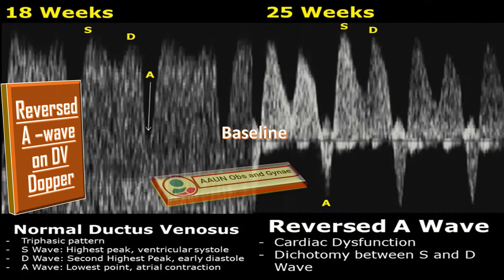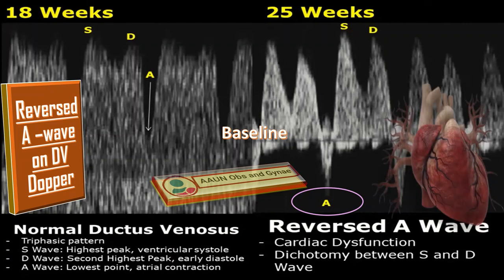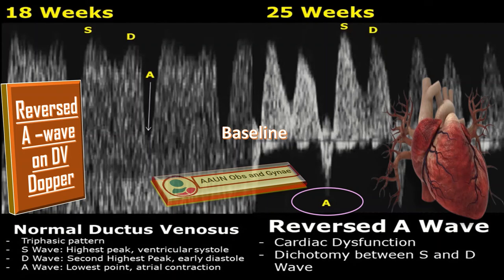Next comes the reversed A wave. The reversed A wave means the A wave is below the normal baseline on the ductus venosus Doppler ultrasound — it is definitely abnormal. Here you can see the baseline, and here you can see the reversed A wave in the same fetus taken at 25 weeks of gestation. The reversed A wave indicates cardiac dysfunction. You can also see the dichotomy between the S and D waves, which are almost at the same levels and closer to each other, further indicating cardiac dysfunction.